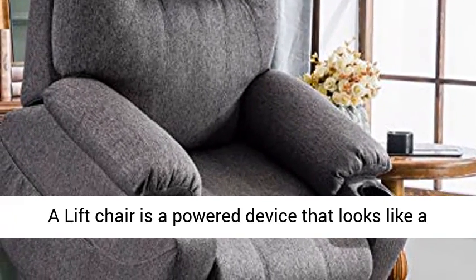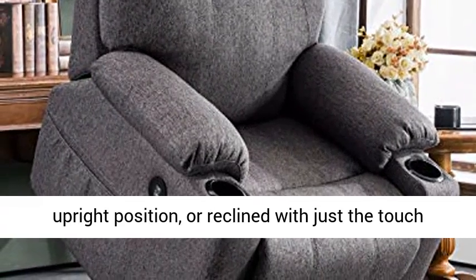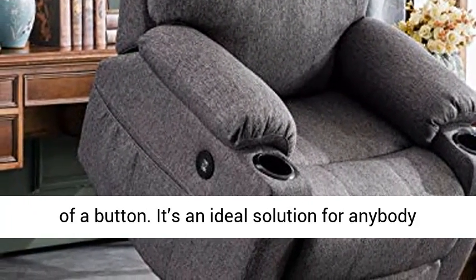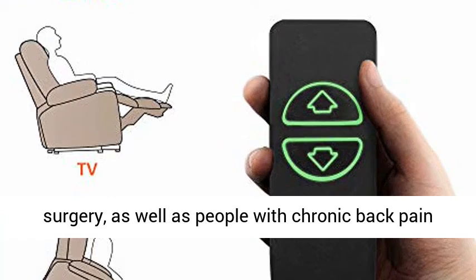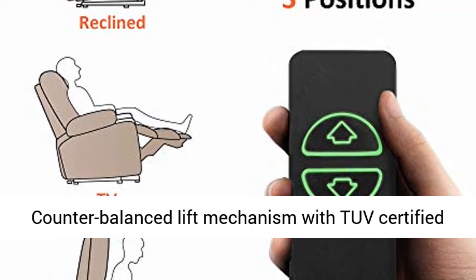A lift chair is a powered device that looks like a conventional recliner. It can be used in an upright position or reclined with just the touch of a button. It's an ideal solution for anybody who has mobility issues or is recovering from surgery, as well as people with chronic back pain who can't get comfortable in a typical chair.